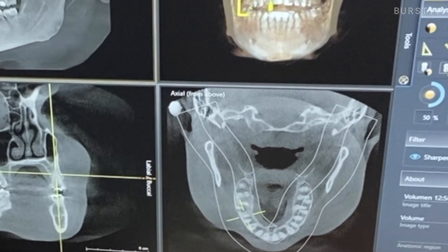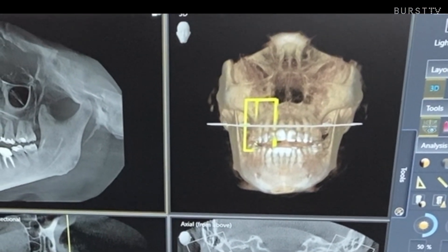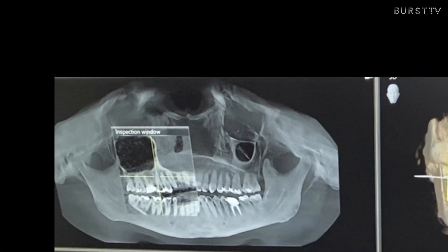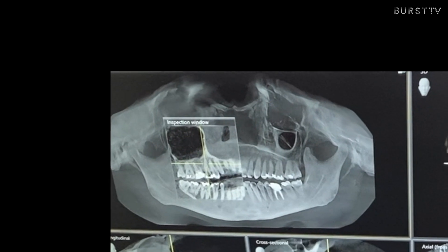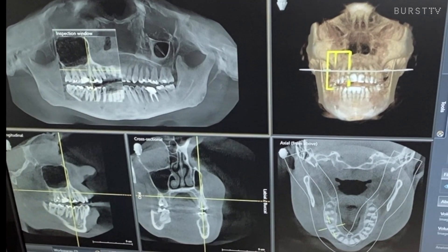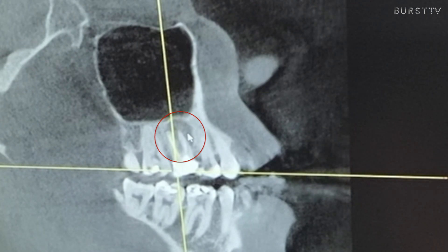If we hadn't taken the scan, we would have missed the large infection or abscess in the patient's upper molar — and it's actually a reinfection. In this particular case, we gave the patient the choice to see an endodontist. Dr. Shirley always gives that option, and if not, we could let them see if they could retreat the area, or we gave her the option to take the tooth out and replace it with an implant. You can see here the floor of the sinus. If the patient were to have denied the radiograph, we would not have known this infection was present.